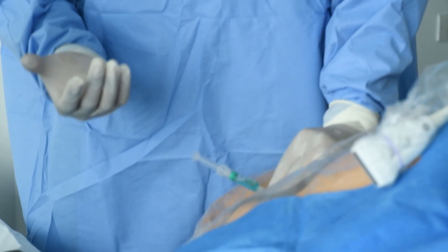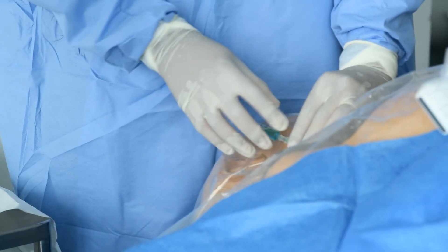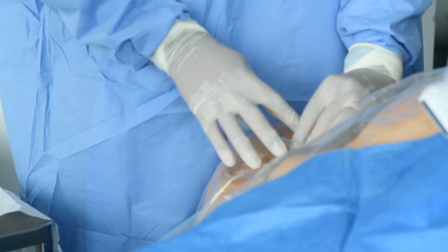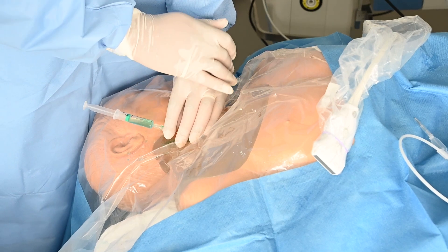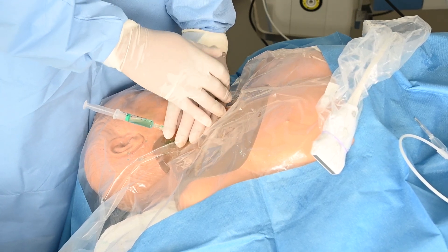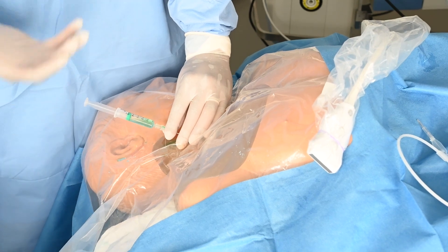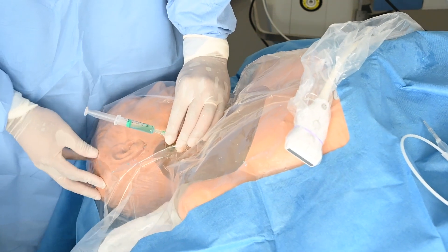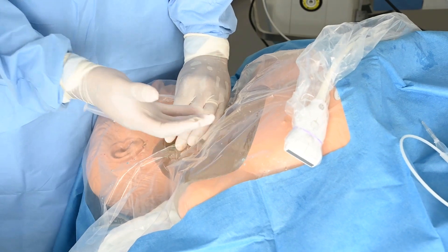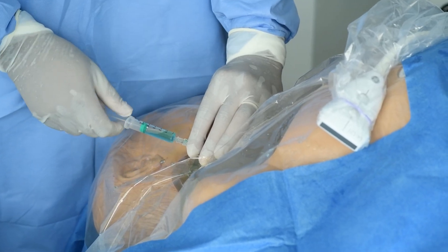I see it done many a wrong way, but what you really want to be doing is grabbing the needle hub with your thumb and your index finger, and then literally getting as much of the surface of your hypothenar eminence or the ulnar border of your hand on the patient somewhere — just on a steady surface. The whole purpose of this is that we should be able to move the patient, move the bed — the patient might move accidentally — but we move with the patient and the needle won't move out of position.